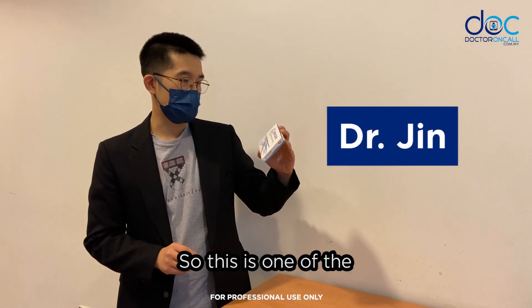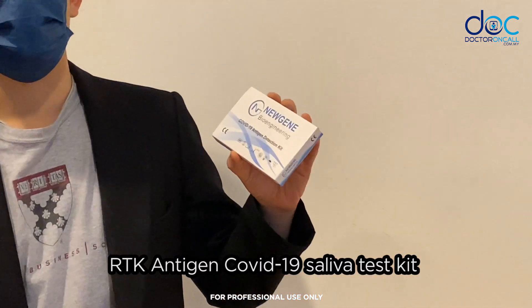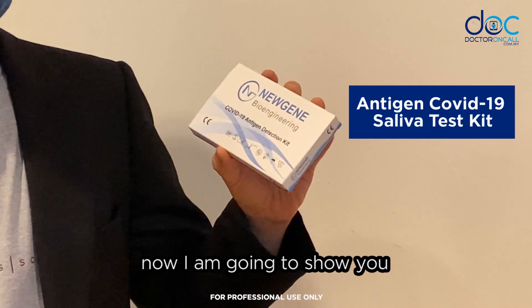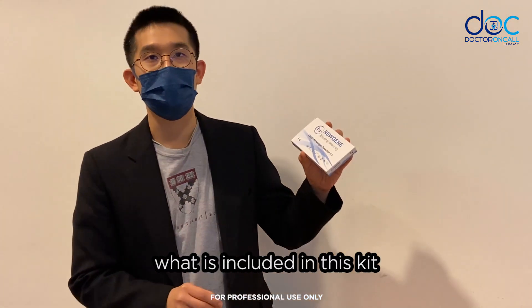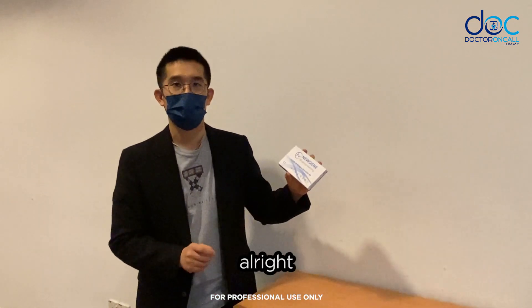This is one of the RTK antigen COVID-19 saliva test kits. I'm going to show you what is included in this kit, and later we'll do a demonstration of how the test is done.